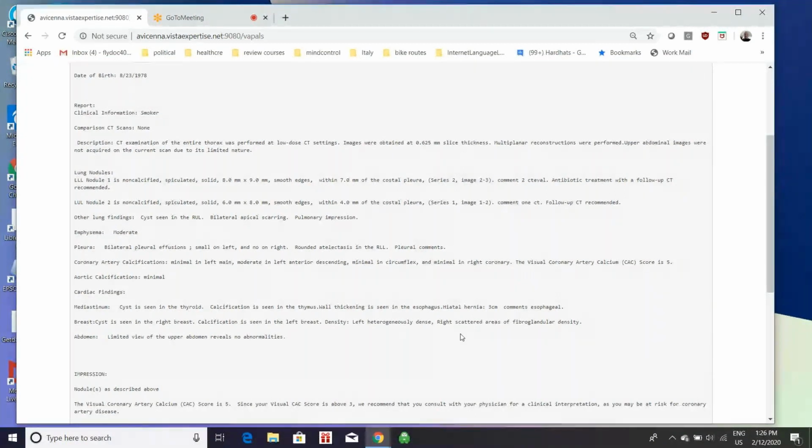And so that's been a major change we did in the last couple of weeks. The problem was that the PowerScribe and templates that were being used in the VA were having a lot of trouble with the HTML formatting that we were putting into the report. So we scrambled and took out all the HTML, and then grouped a lot of the generated text in the same groupings that are wanted for the report.